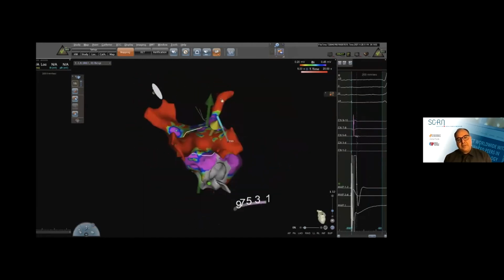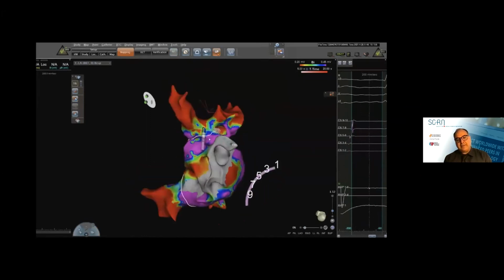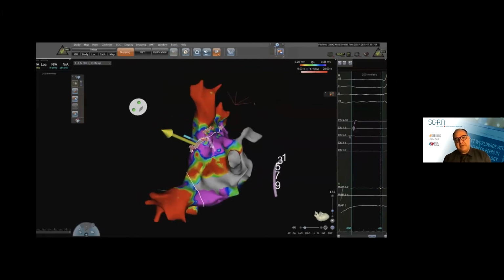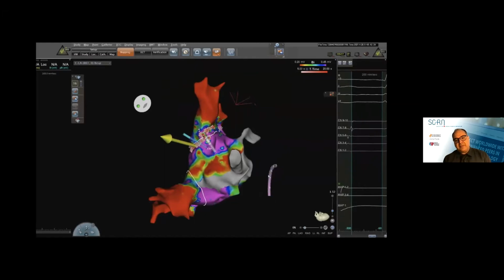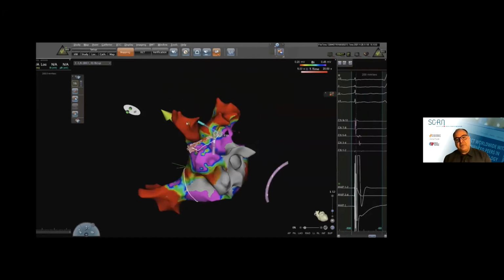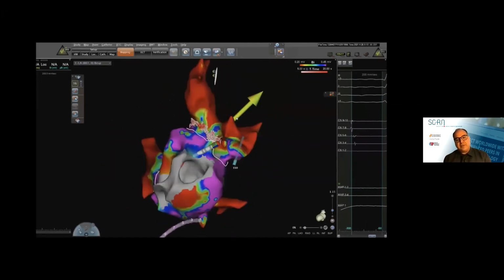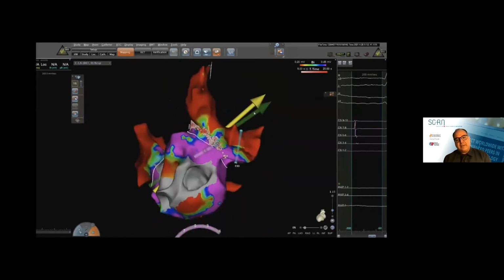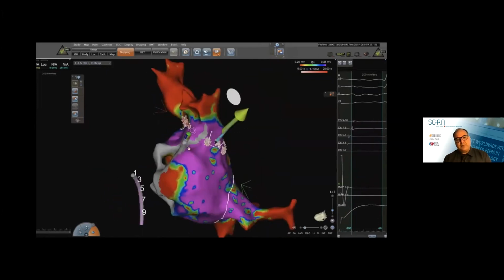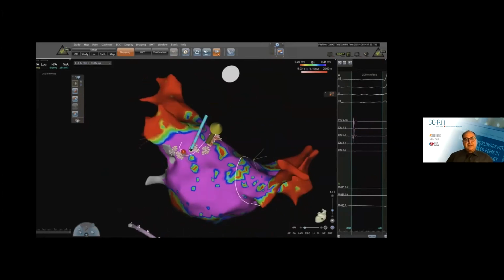The other thing that you notice is because I'm actually sitting behind the console, I'm adjusting the map as we go. So I delete and fill the map, because with the Pentaray, one of the downsides is that, I know Tamas is very keen on actually creating a map with the ablation catheter because it's more accurate. What I'll do is delete and generate the anatomy as I'm ablating. This way I save some time and then create a very accurate map. So we'll go back again to the posterior where the temperature went up, deflected anteriorly.